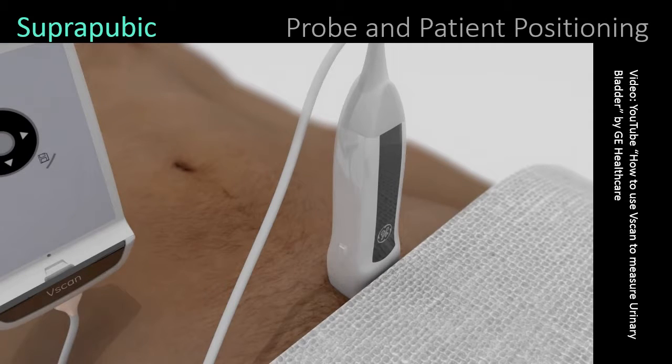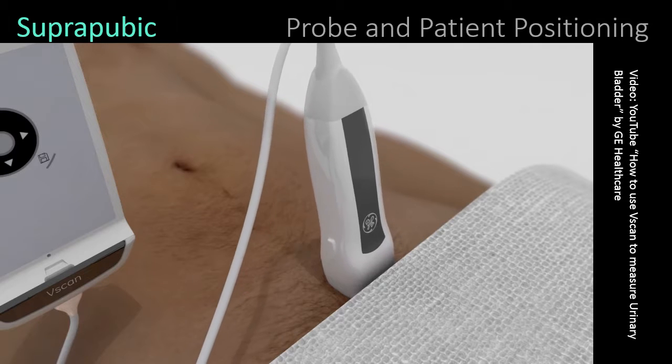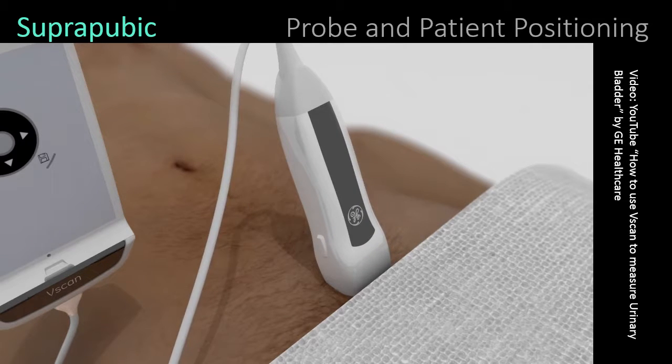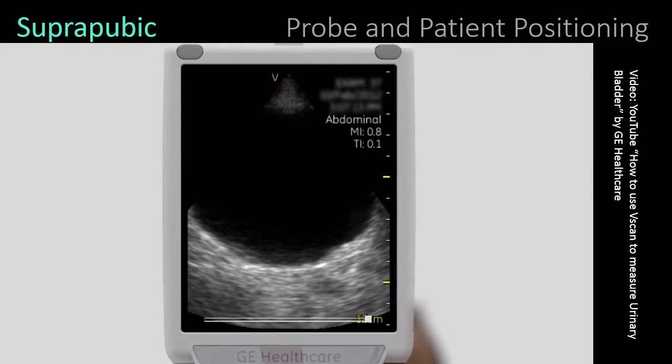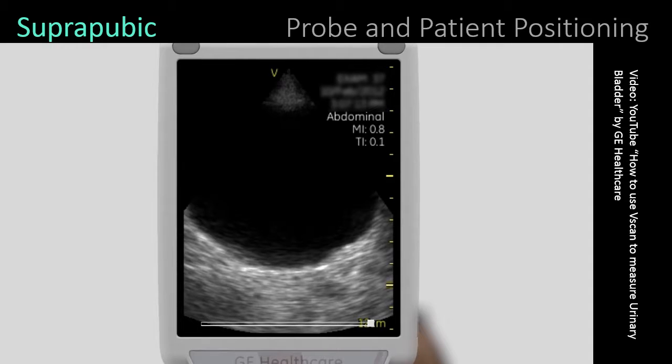To obtain a transverse view of the bladder, position the probe so that the probe marker is pointing toward the patient's right. The urinary bladder is a pelvic organ, so the transducer must be positioned just superior to the pubic symphysis and aimed into the pelvic cavity. In the transverse view, scan the bladder from the proximal to distal end. Obtain a mid-transverse image where the width of the bladder appears to be at a maximum. Adjust the gain and depth to obtain a diagnostic image.